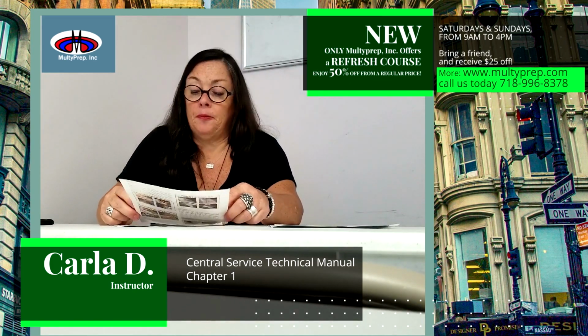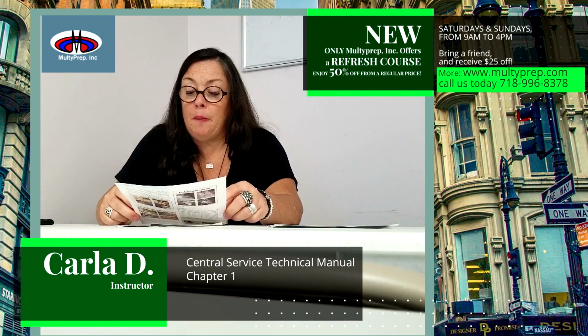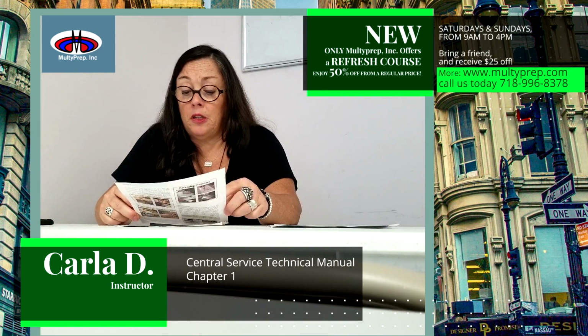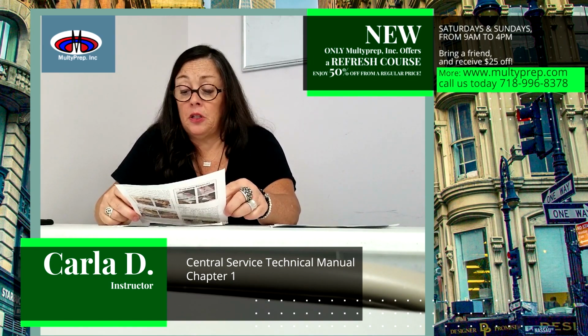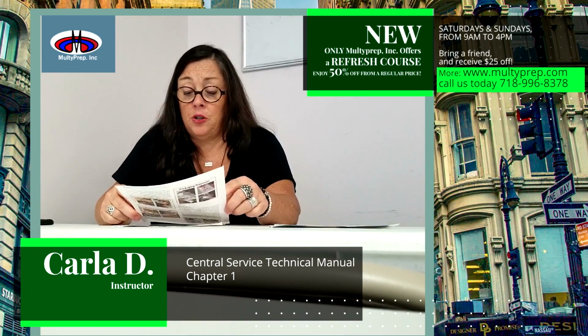Preparation and packaging. After items are safe for handling, they are delivered to the prep and pack area of the CS department. Each item is carefully inspected for cleanliness, proper function, and possible defects. Instruments and other devices are assembled, packaged, and labeled in preparation for sterilization.